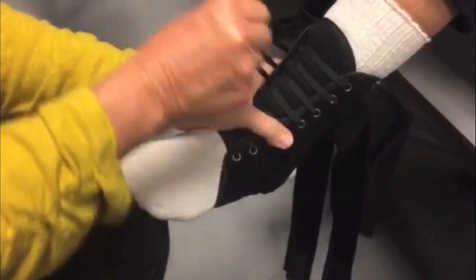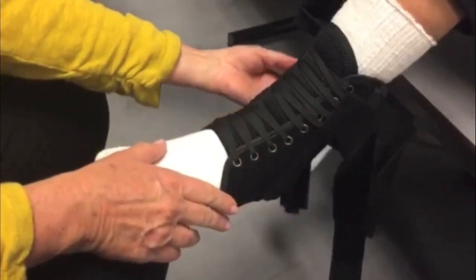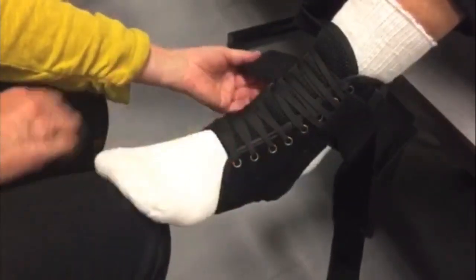Next, when the ankle brace is completely laced, the width between the eyelets should be approximately one to one and a half inches.